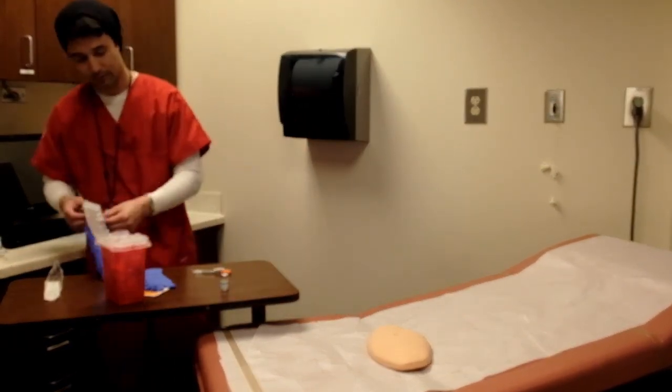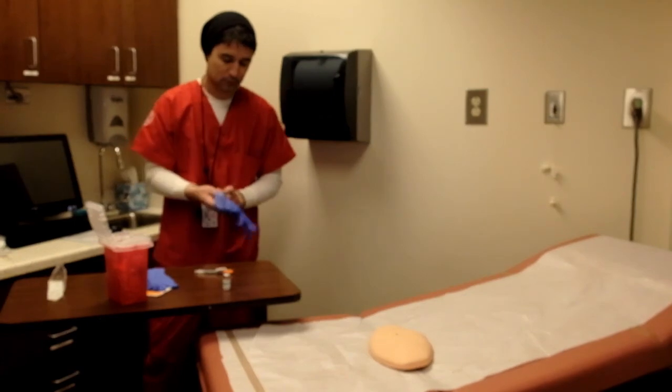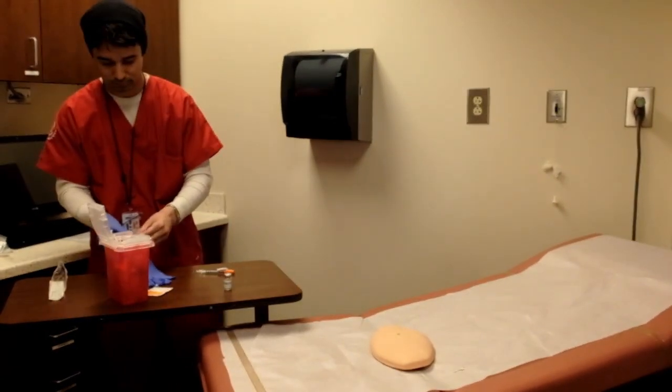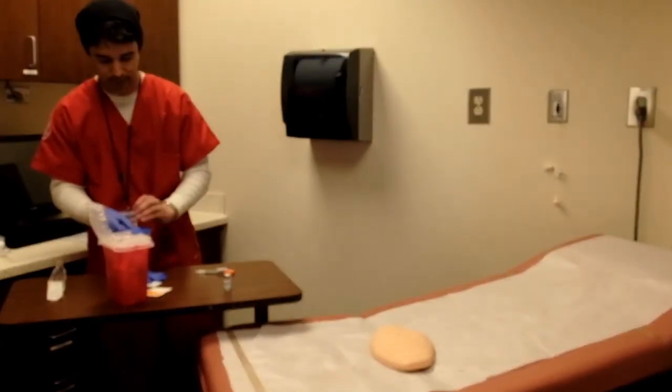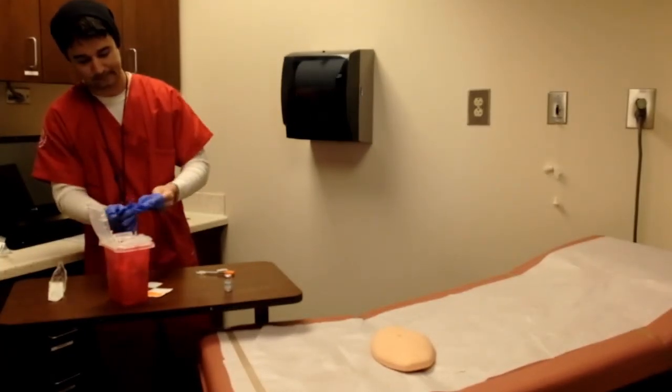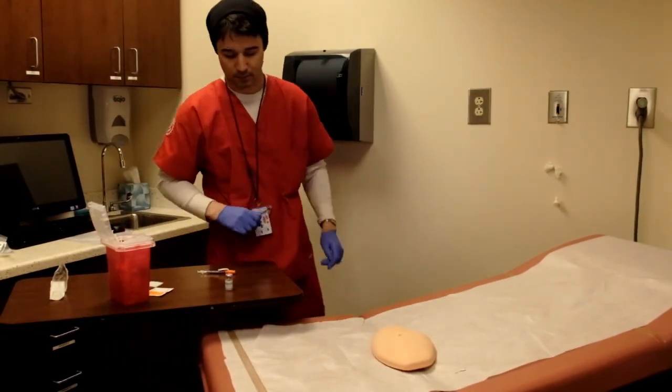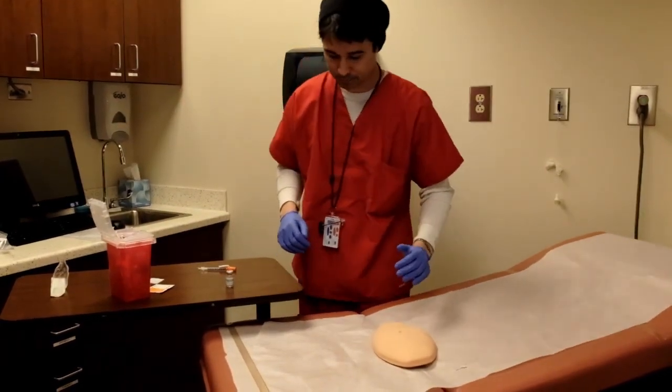So at that point, we've already practiced our hand hygiene. Glove up. One glove. Two gloves. And we're going to get ready to do what we came here to do.